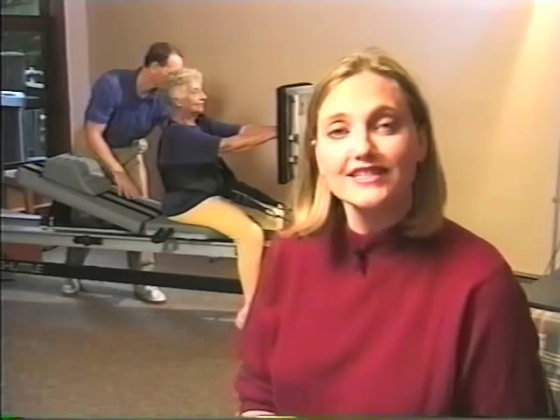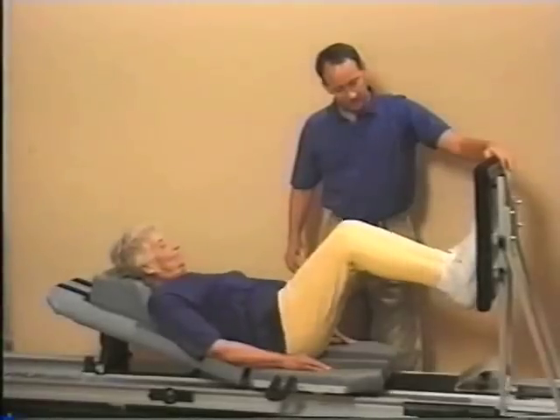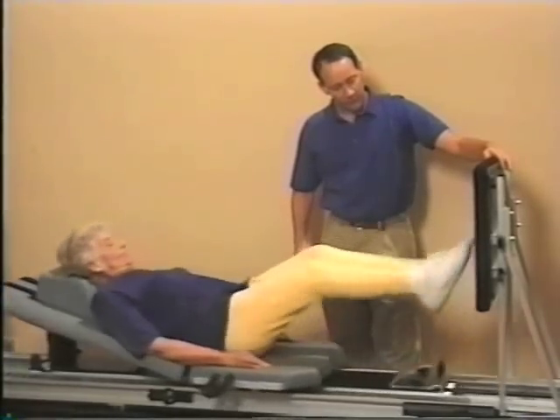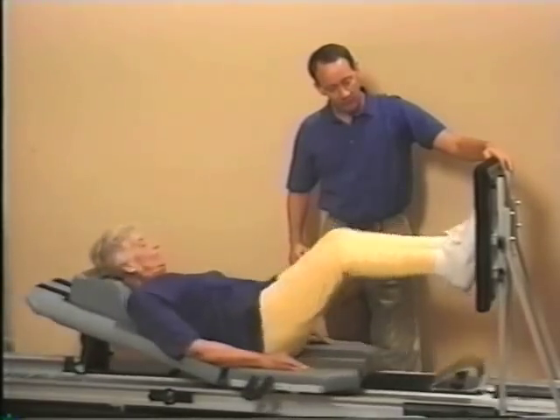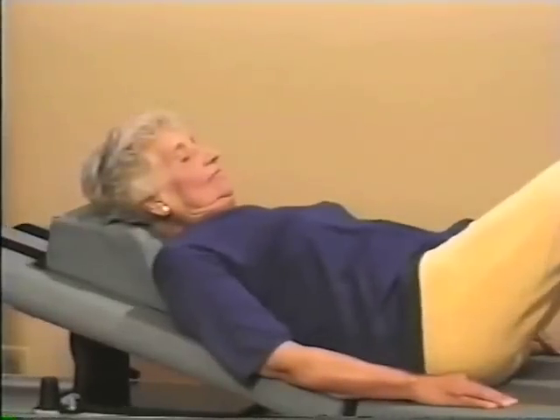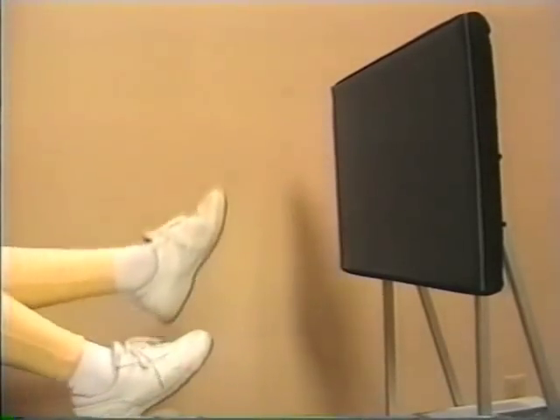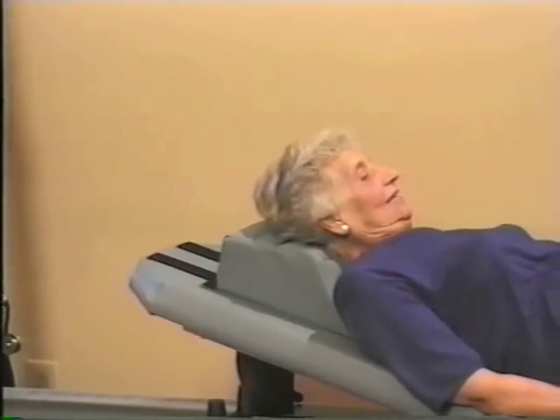With a little imagination, the exercise possibilities on the shuttle are virtually endless. For instance, going down a set of stairs can be a real challenge for some people. With minimal resistance and distance traveled, proprioceptive exercises involving small — or as we call them, soft plyometrics — can be an invaluable exercise to stimulate that essential feedback for the various mechanoreceptors surrounding the joint and within the musculature.